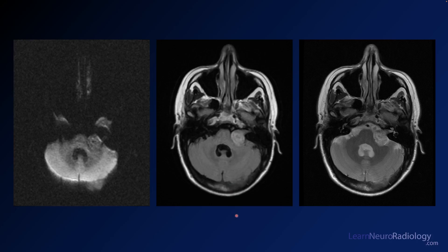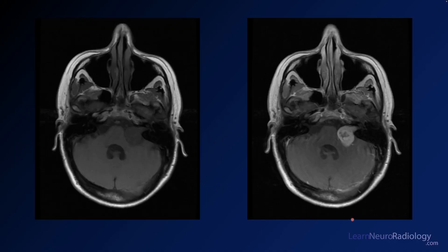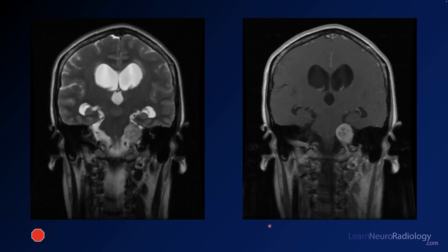Here we have a couple of images through the level of the pons. It can be hard to tell what type of images you're looking at when you're looking through the posterior fossa, but this is a diffusion image, a FLAIR, and a T2-weighted image. We also have a pre-contrast T1 and a post-contrast T1-weighted image, as well as coronal images — a coronal T2 on the left and a coronal post-contrast on the right.